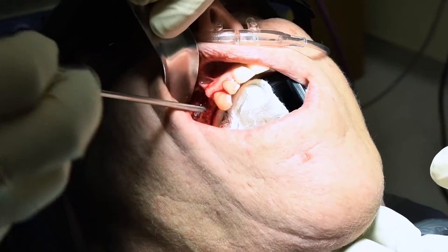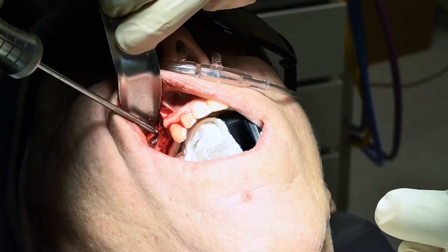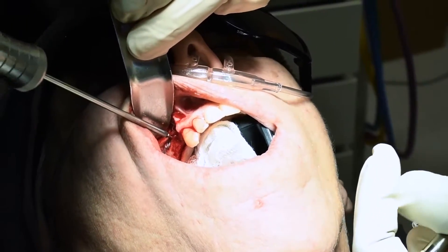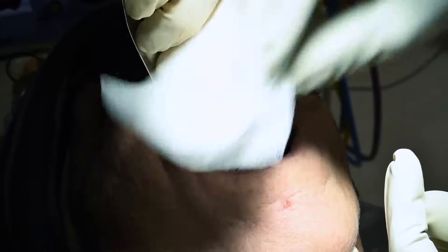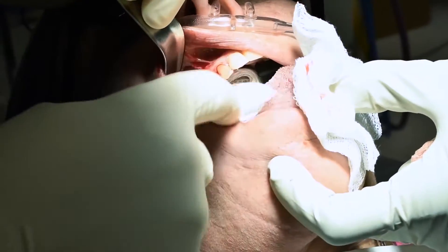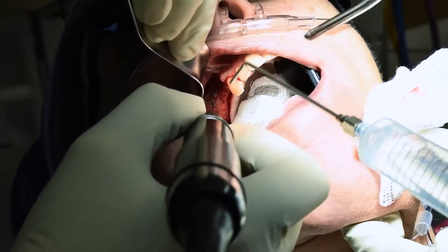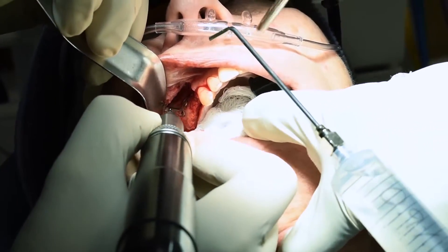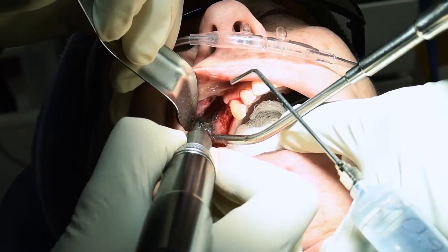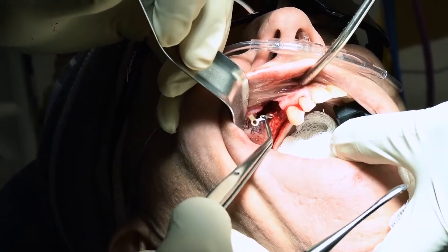You just need to bring it closer if you don't mind. Kelly mosquito pickups. She wants to keep this hardware. So we're going to cut the plate right here, cut the wire. We'll just lift off and pick it up. There's the hardware.